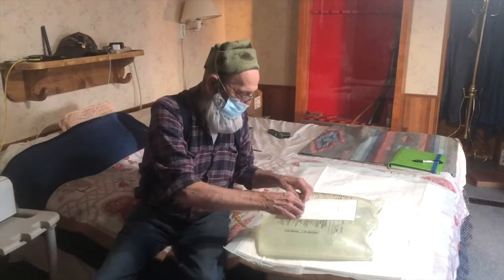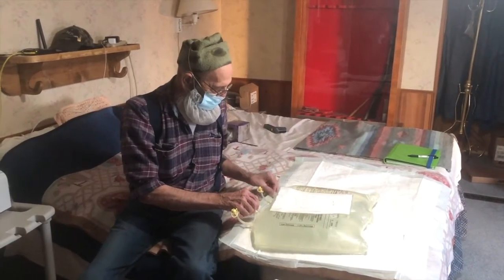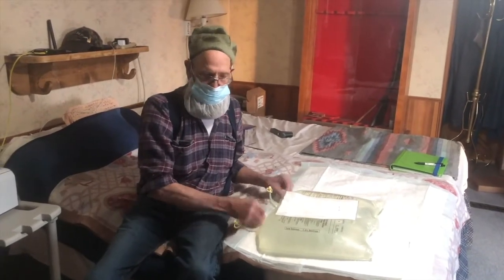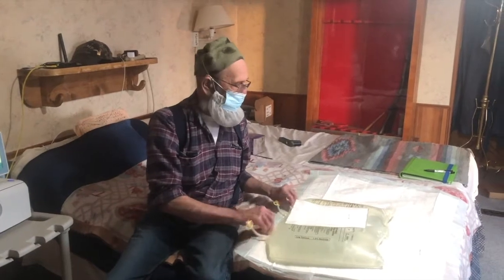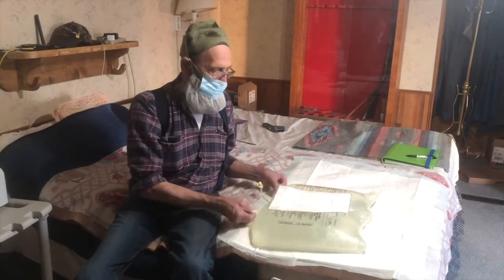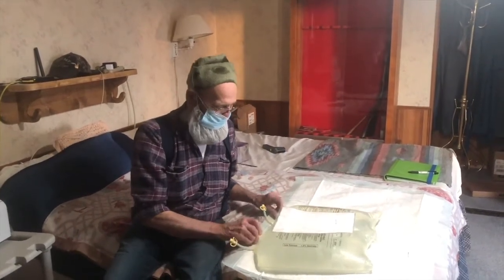So anyway, this is bleach that I've cleaned all these ports with, and you have to make sure you get them scrubbed down really good. All this stuff they furnished to me, these pads, everything but the paper towels. They would do that if I said something, probably, but I'm not going to. One thing they can't furnish is the view though. Shall I open the door?